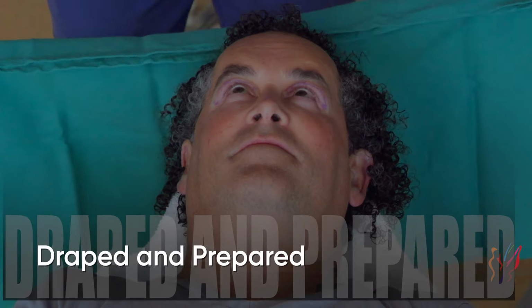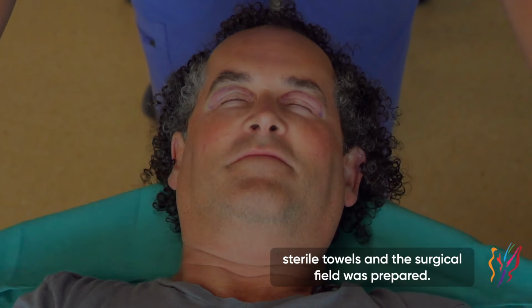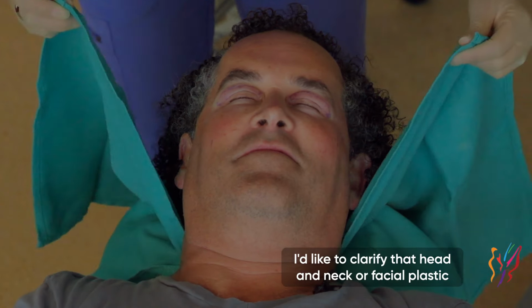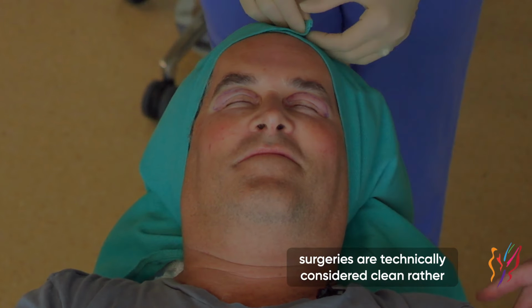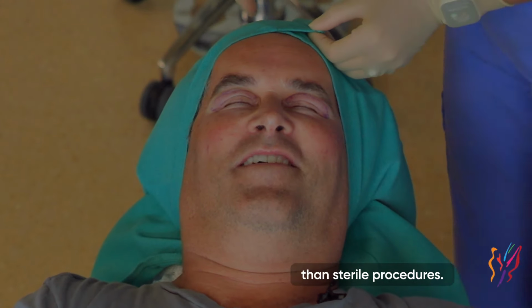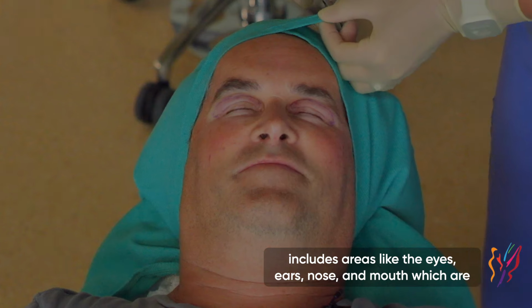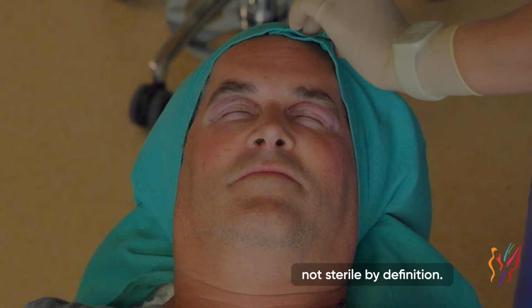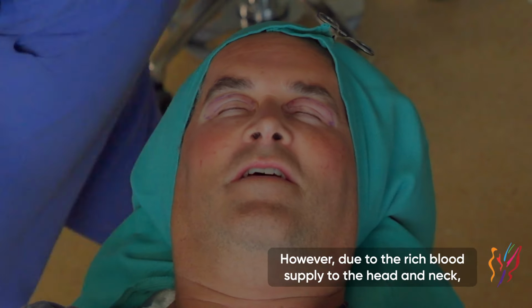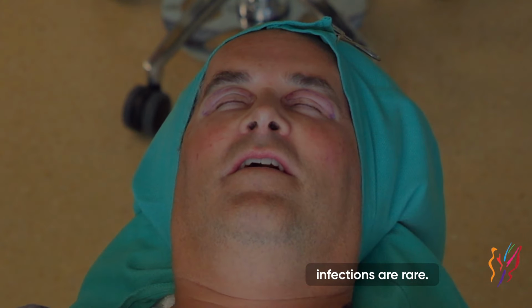Once the eyelids were measured and marked, I was draped with sterile towels, and the surgical field was prepared. I'd like to clarify that head and neck, or facial plastic surgeries, are technically considered clean rather than sterile procedures. While all instruments and gloves are sterile, the field includes areas like the eyes, ears, nose, and mouth, which are not sterile by definition. However, due to the rich blood supply to the head and neck, infections are rare.